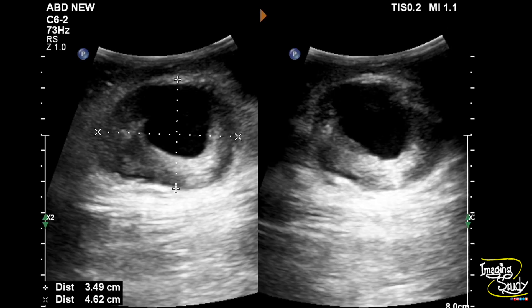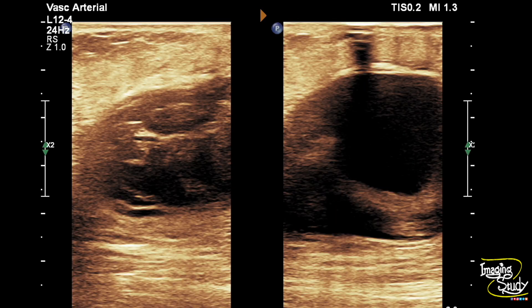Now let's look at some pictures. Here you can see the approximate measurement of the saccular aneurysm — it is around 4.6 x 3.5 cm. The lumen shows mural thrombi. In another superficial view, you can again see the aneurysmal dilatation with luminal mural thrombi.